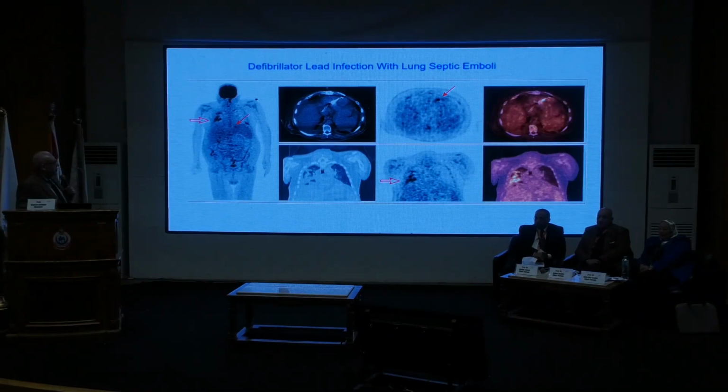Infection related to defibrillator with septic lung emboli, multiple areas of increased uptake in the lung.